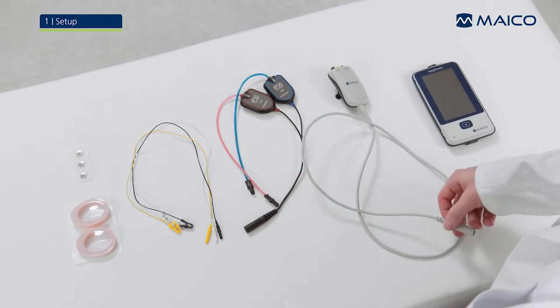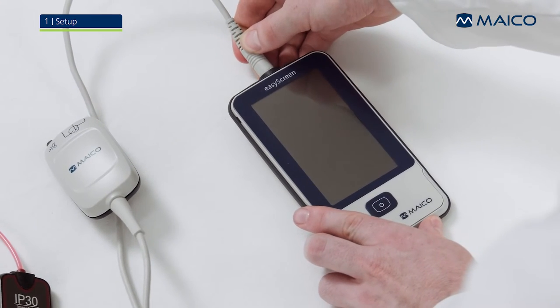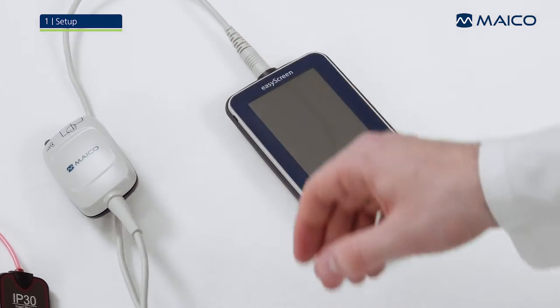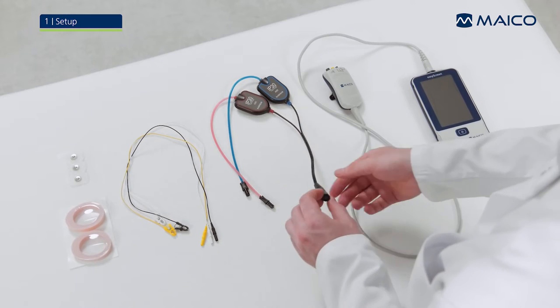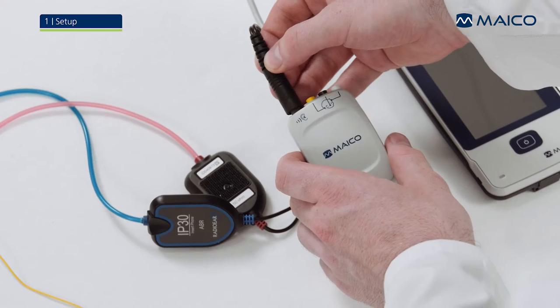Connect the pre-amplifier to the EZ-Screen. Search for the dots on the connector and push the plug straight into the socket. Now connect the insert phones to the pre-amplifier using the same technique.